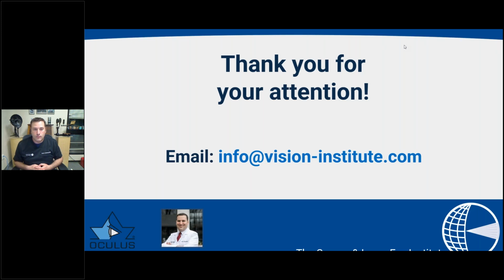Stephen, I have one final question for you, and it's something that we didn't talk about tonight. When considering a multifocal or EDOF IOL, do you look at chord alpha? And if you do, what do you look at?